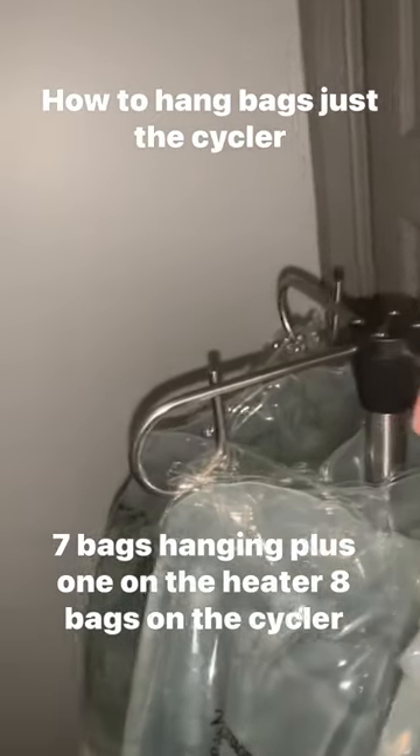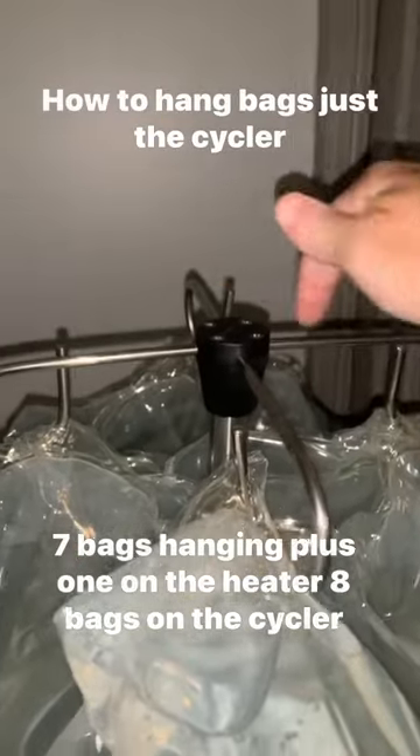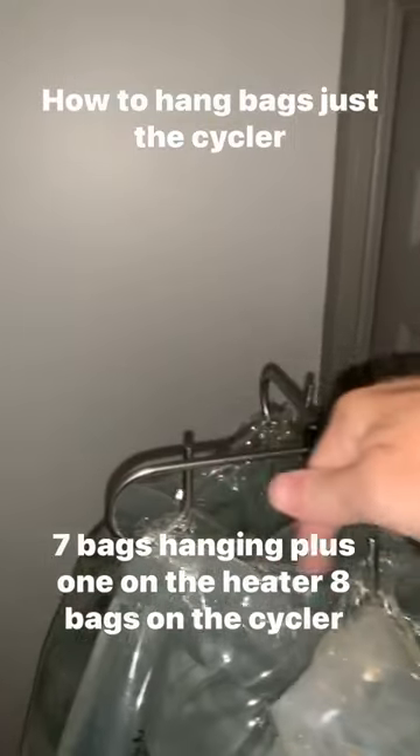I put one this way. So I hook it from this one to this one. So I have one this way, one this way — that's two. And then three, four, five, six.